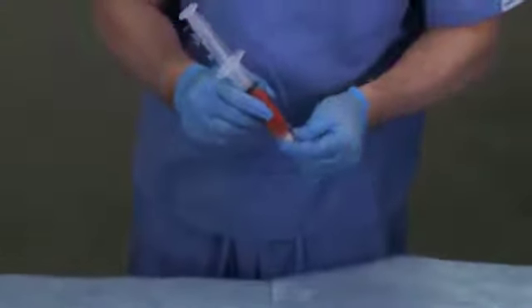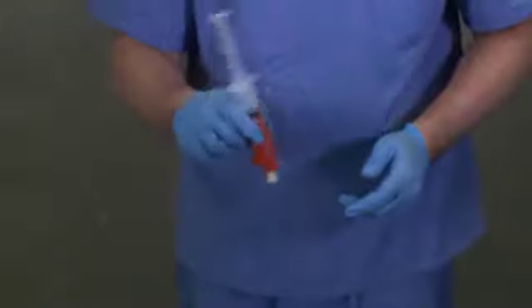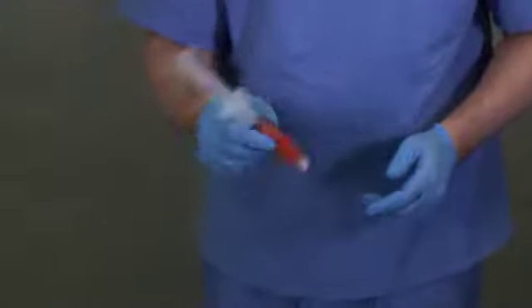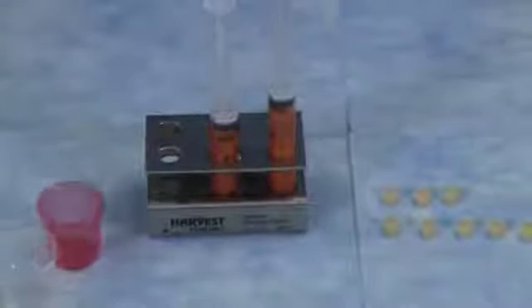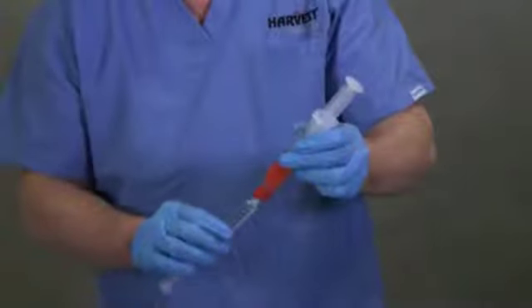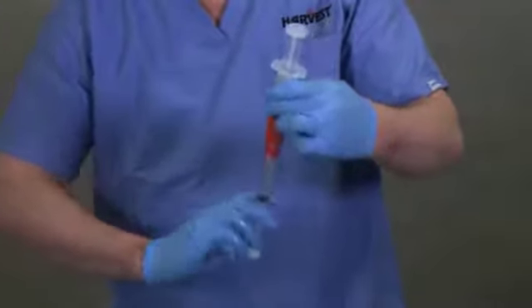Place a tip cap on the wash syringe and invert the wash mixture 3 to 5 times. With the tip cap facing down, place the syringe vertically into a decant rack. Allow the wash mixture to settle for at least 1 minute. While the first sample is settling, complete the wash steps for the second collection syringe.